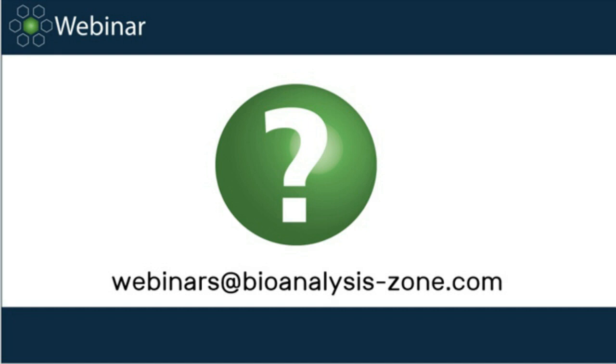So if you see a parallelism issue, sometimes it is not a bad idea to play a bit with some of the sample treatment conditions. And by the way, that is one of the reasons that parallelism should be looked at, and I kept saying that it should have been looked at early on during your assay development or kit evaluation. Try to include that early on.